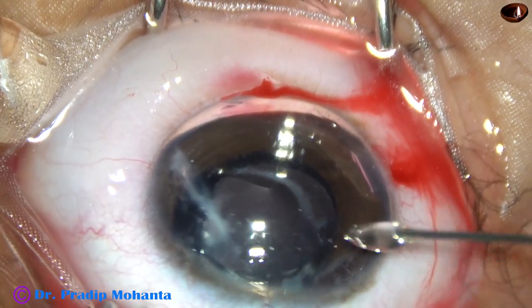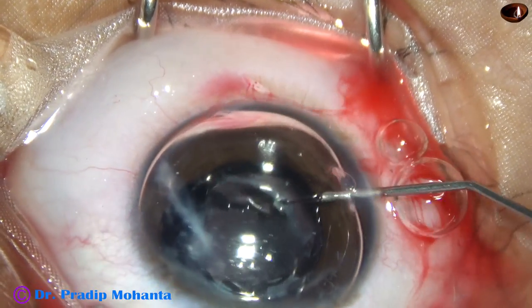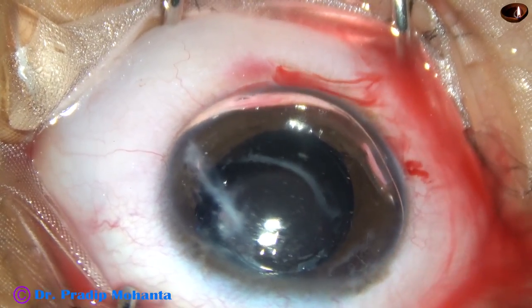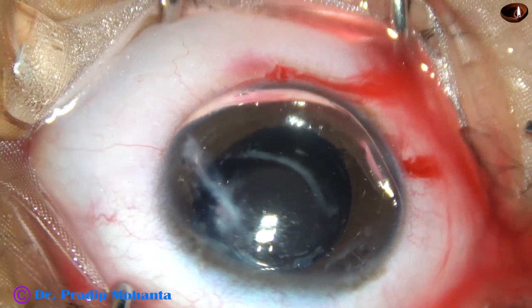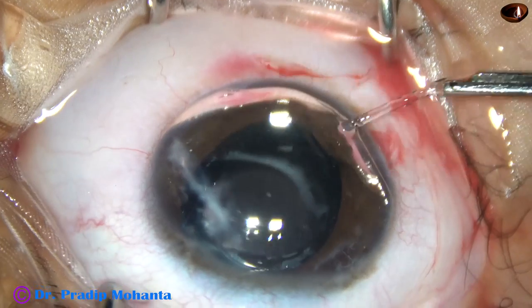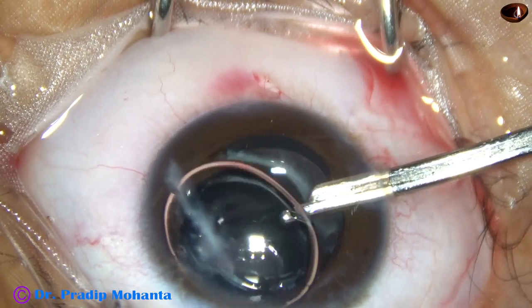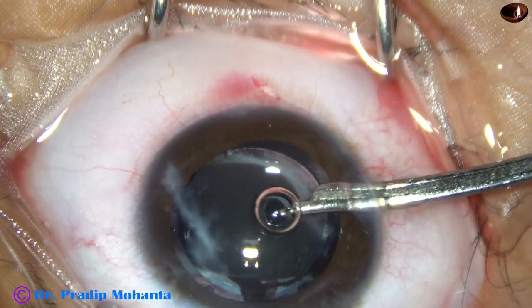Now I am trying to hydrate the port that has been used for the anterior chamber maintainer. After hydrating, this is a bit of moxifloxacin. And now I am going to see if the anterior chamber remains formed or if I need a suture.